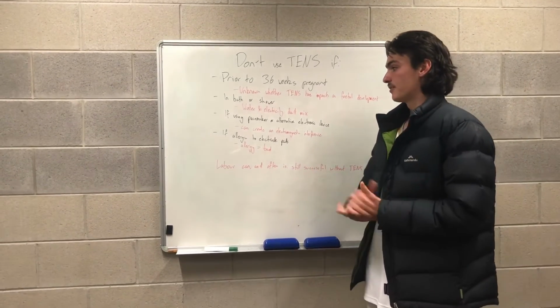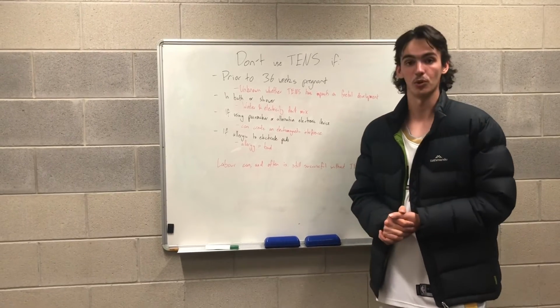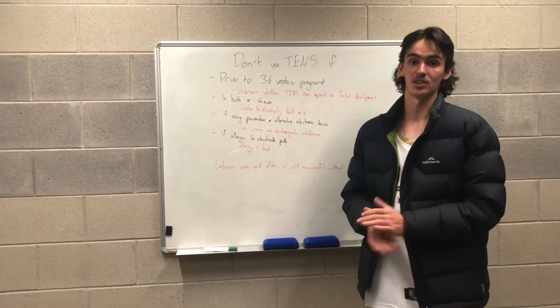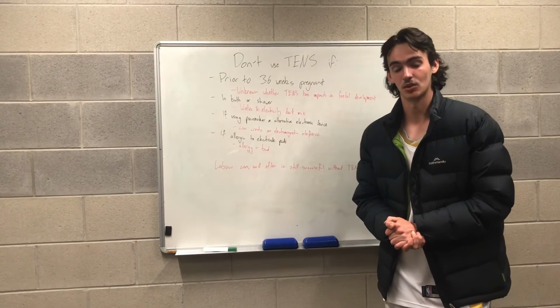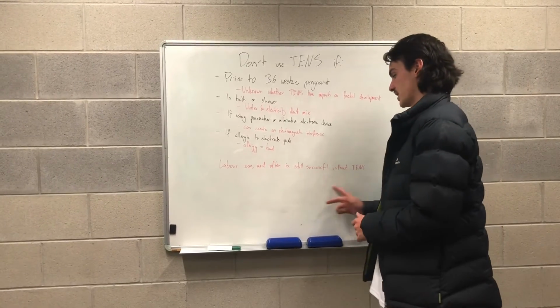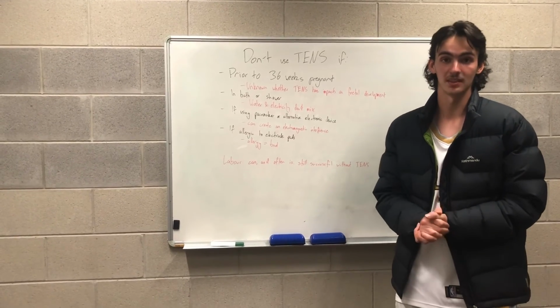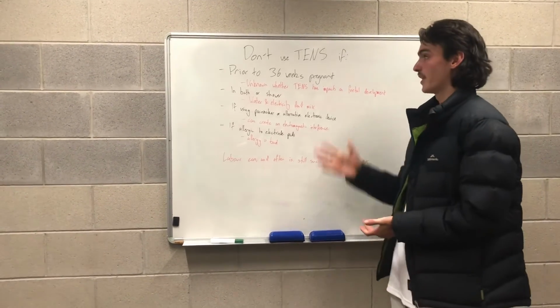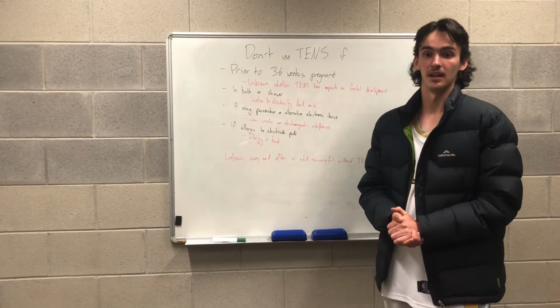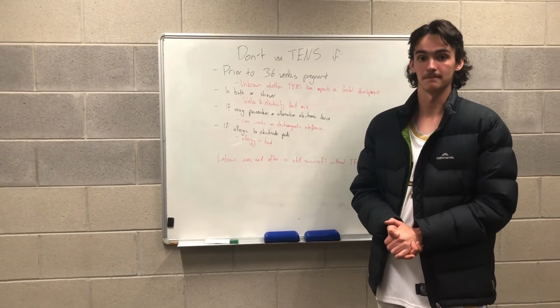And finally, if the patient has an allergic reaction to the electrode pads that are to be placed on the body, obviously having an allergic reaction, especially during labour, is something that's not ideal for anyone. And the final point I've just written down here is that labour can and often will still be successful without the use of TENS. So if any of these are to be a barrier, it's still okay. It's completely fine to complete labour without the use of a TENS machine.